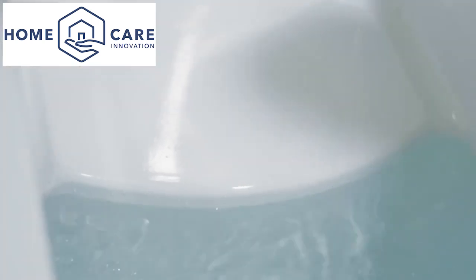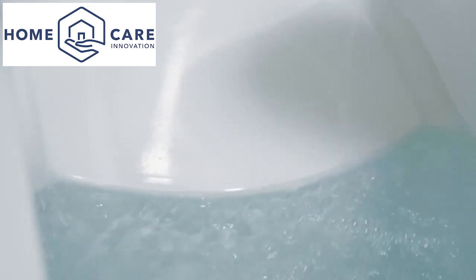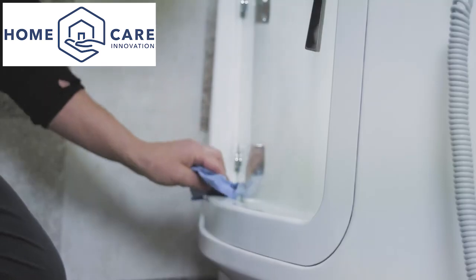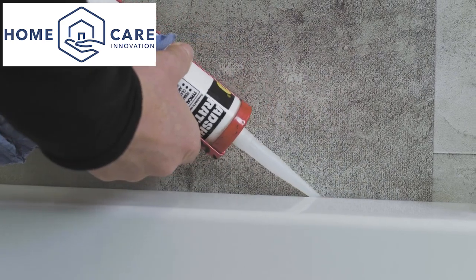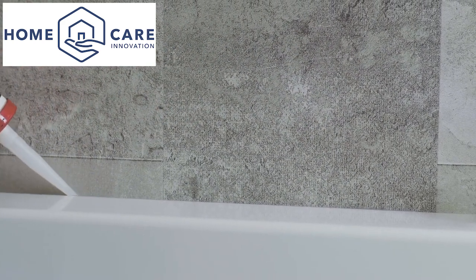Fill the bath with water and check for leaks. Every bath is water tested before dispatch, so provided the bath has been installed correctly, there should be no issues. Seal the bath to the wall using a high-modulus antifungal silicone sealant. Applying the sealant when the bath is full of water ensures a better seal, as the sealant cannot become stretched.